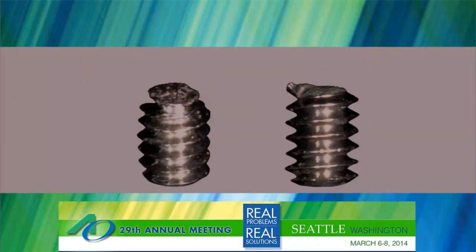Okay? So to really understand how one might relate to the other, these are two fragments that I recovered. They're both metric 1.6 fragments, but they're really different in scope. The one on the left has a fracture through the screw body itself, and the threads aren't really involved. So the fracture zone with those sharp edges is not out in the threads, complicating removal. The screw fragment on the right side has been fractured through the threads itself, and there's a sharp corner on that top left side, and that's a potential problem.